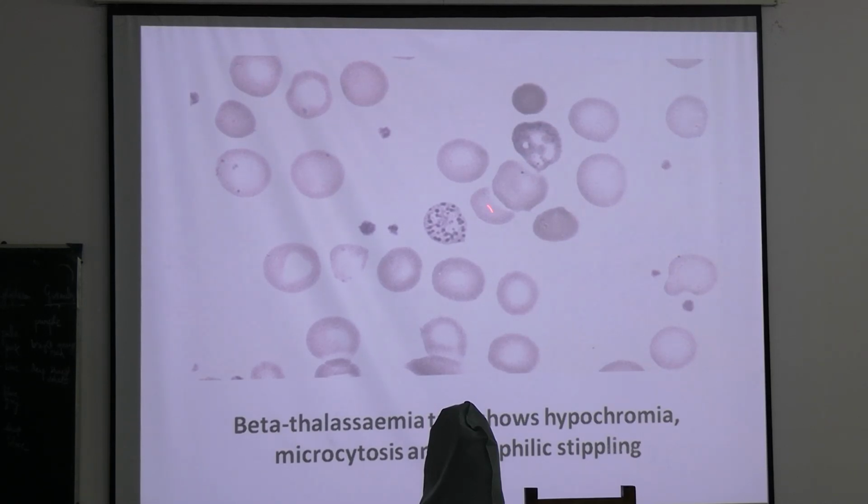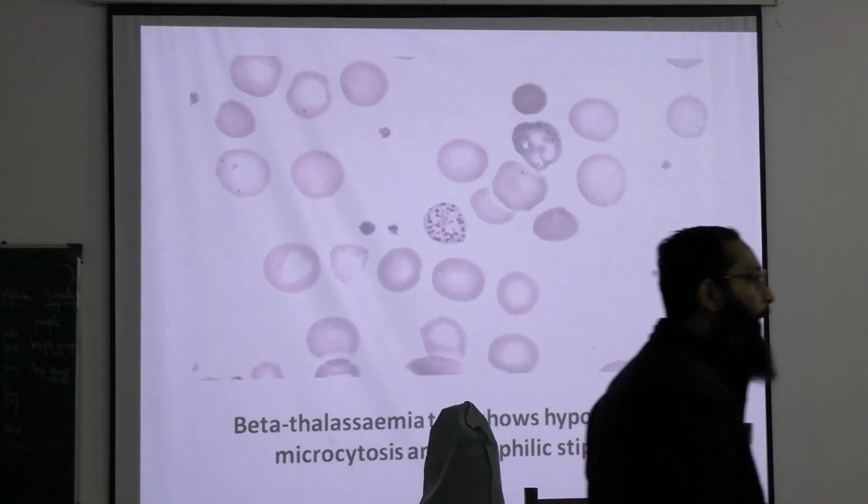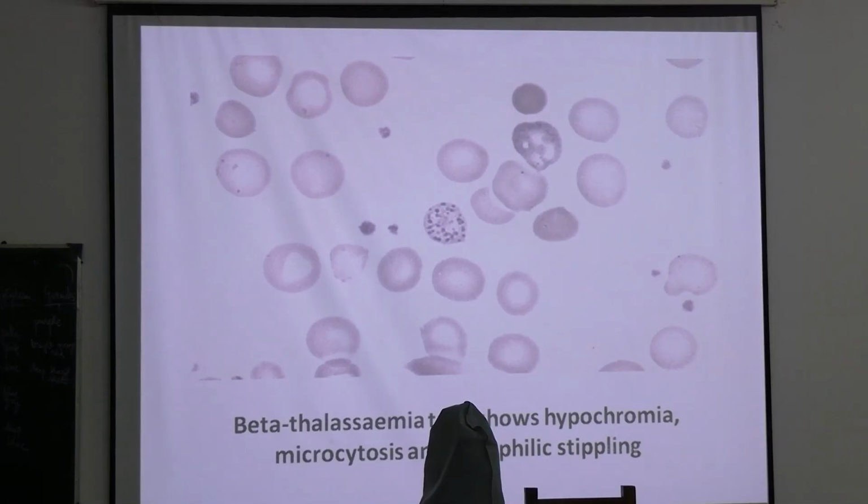What is this? Can anyone identify it? This one. Can anyone tell? This is actually basophilic stippling.